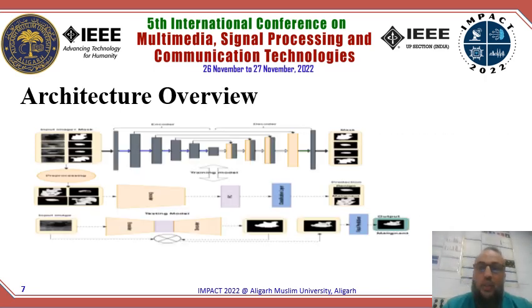This architecture depicts the proposed CAD system. Firstly, we use the segmentation model to automatically localize and segment the breast tumor from BUS images. After that, the segmentation mask is multiplied with the input BUS image to extract the breast tumor region. Finally, the CAD system uses a deep learning texture extractor to extract texture information from the region of interest to classify the segmented tumor as benign or malignant.